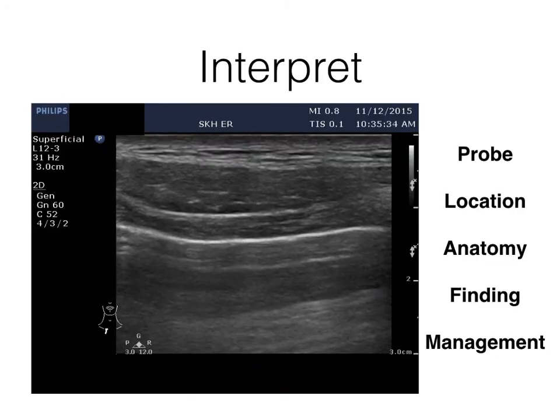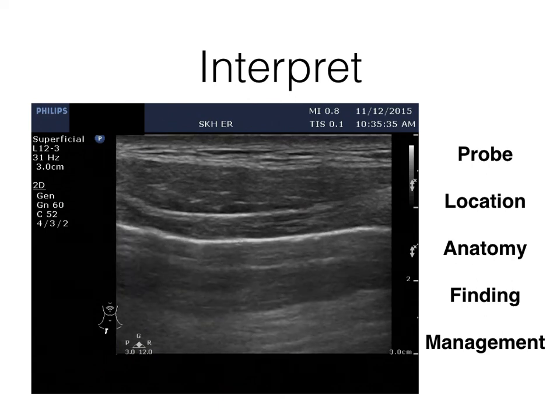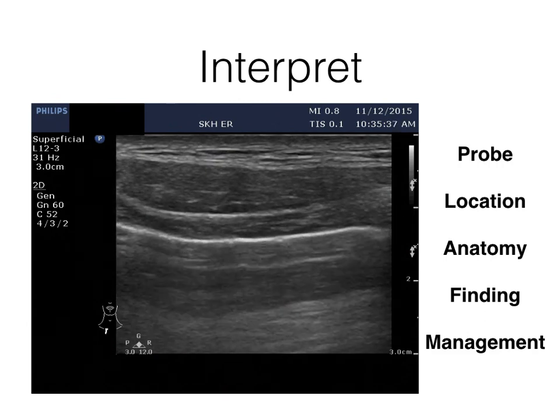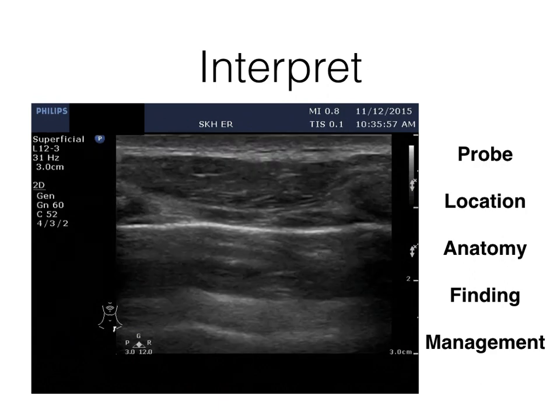Now, challenge again. 19 years old boy got trauma. Normal or abnormal? A linear one, scan on the right chest. The patient has chest pain and difficulty breathing. Normal, right? Sliding, smooth surface with A line, no problem here. So shift to the left chest.